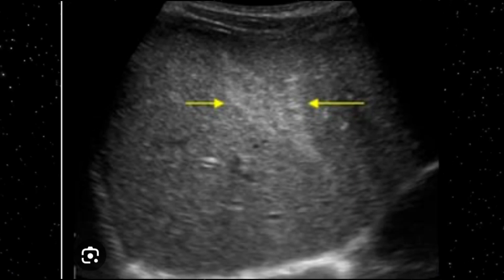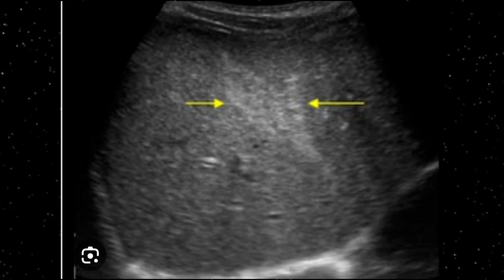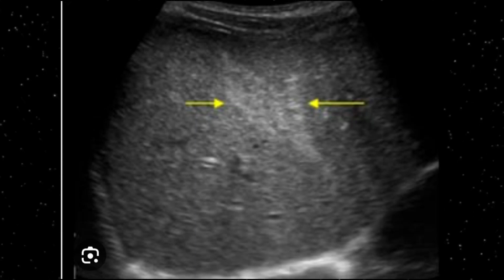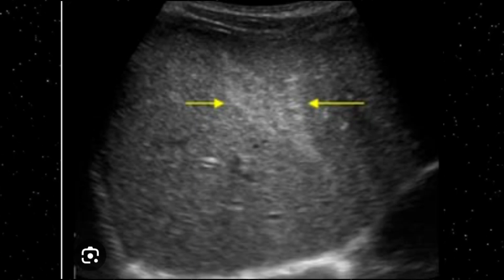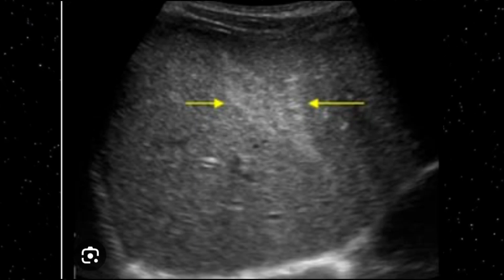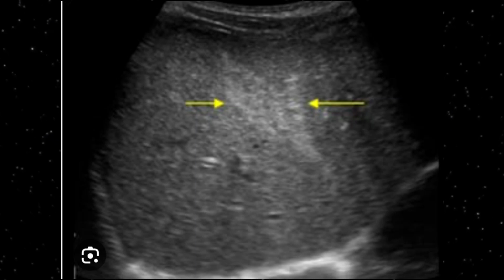In the trauma section, this patient's ultrasound examination revealed intraparenchymal bleeding. This yellow area indicates intraparenchymal bleeding. Hemorrhage always appears echogenic as it is parenchymal hemorrhage. That's why within the liver you can appreciate a patchy echogenic area suggestive of hemorrhage.